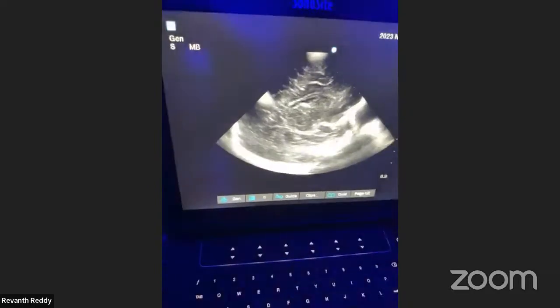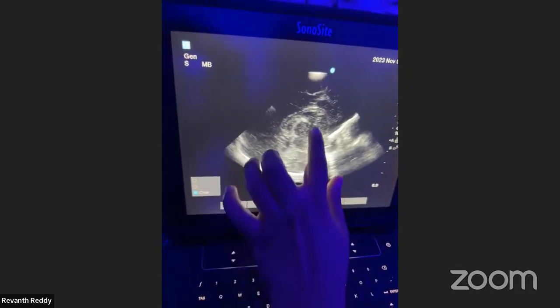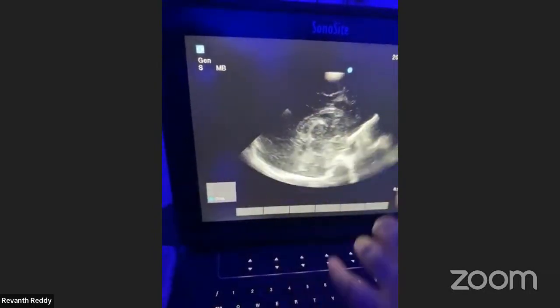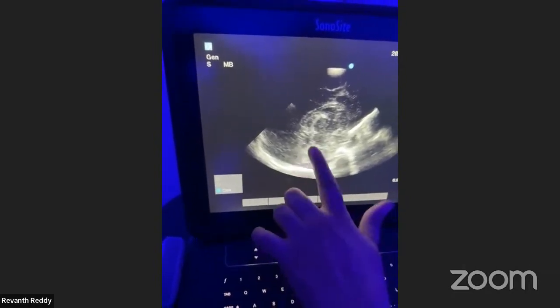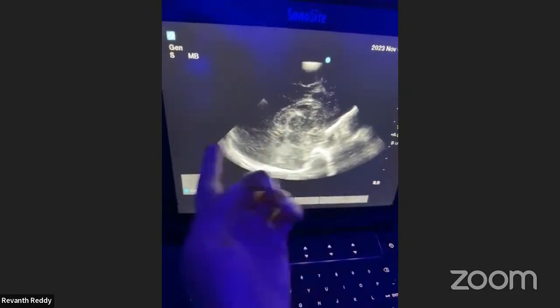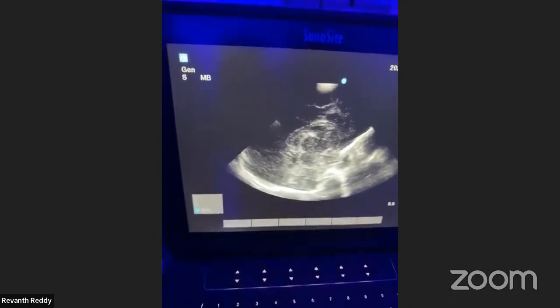And if you tilt the probe even further, you will be seeing the, so I'll freeze now again. This is the origin of the choroid plexus and this is the guitar sign. If you imagine the body of the guitar and the handle of it, this will be the cerebellar vermis, and the third ventricle will be extending down to the fourth ventricle. Posterior to the cerebellum, you will be seeing the occipital lobe. Anteriorly, you will be seeing the pons and the medulla.